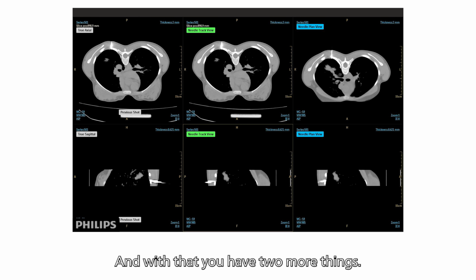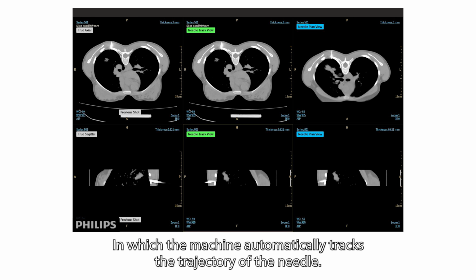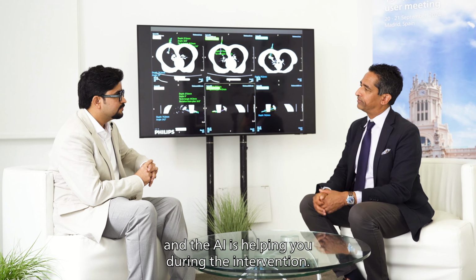Okay. And with that you have two things more. One is the green part and another is the blue part. The green part is the needle tracking view, in which the machine automatically tracks the trajectory of the needle. Basically, stay on to the plan as much as you can, and the AI is helping you during the intervention.